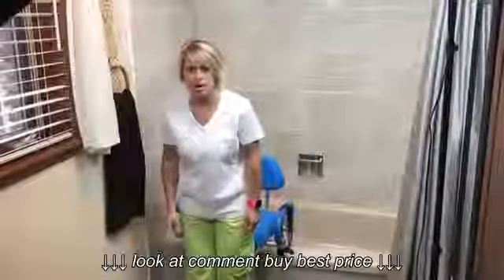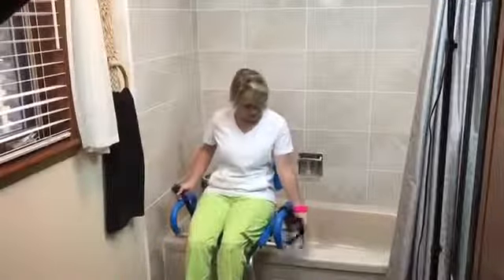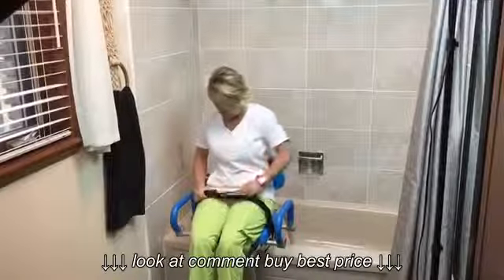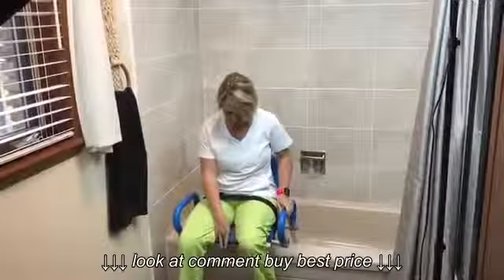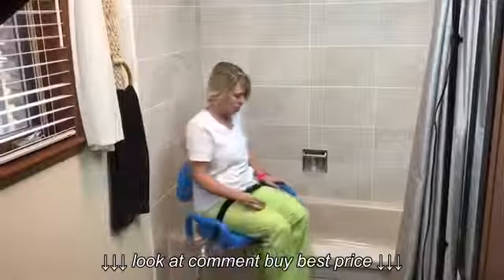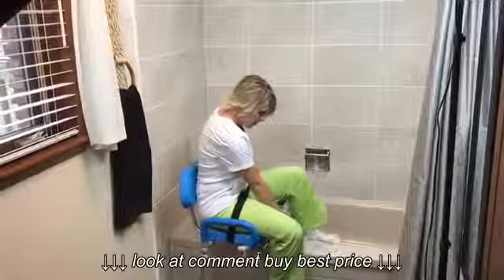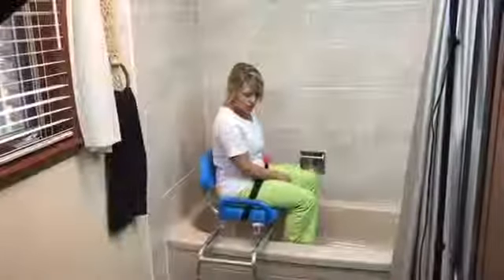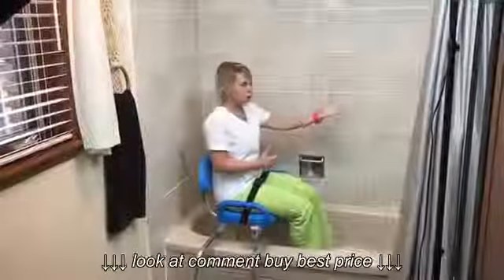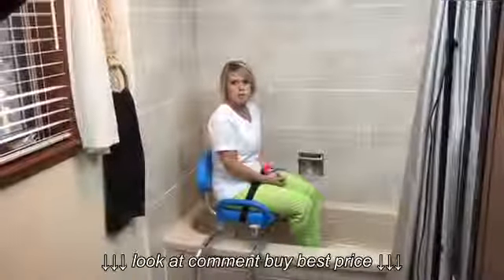I'll do the same — back up, get on the seat and get comfortable. Grab the lap safety belt and adjust it appropriately for you. Then I'm going to press this red lever and give myself a little spin, and it's going to lock in place. I have a little gray lever here that I push in, which allows me to slide over. It locks in place — go ahead, grab your shower wand and start doing the bath.